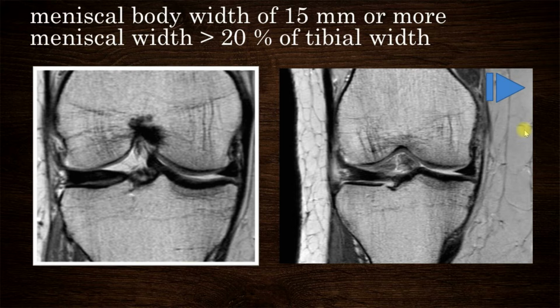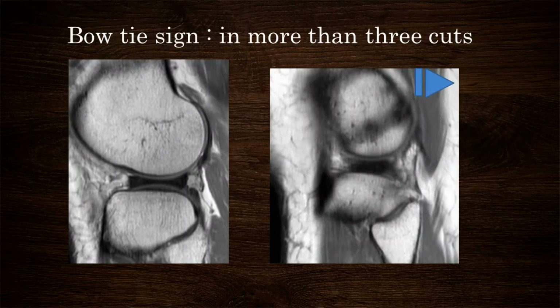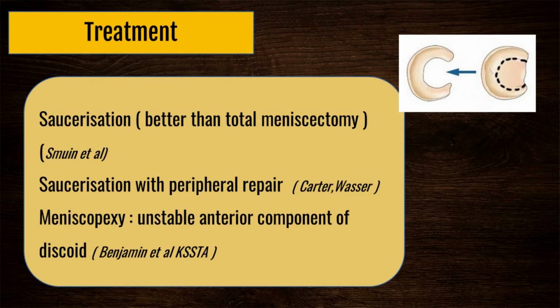In a sagittal section, if the bow tie sign can be seen in 3 or more cuts, it once again suggests discoid meniscus. Treatment is saucerisation, in which the central portion along with the tear is trimmed to give the discoid meniscus a proper shape. If there is a peripheral laxity, a suture repair is also advisable.